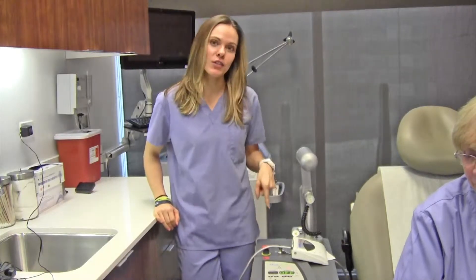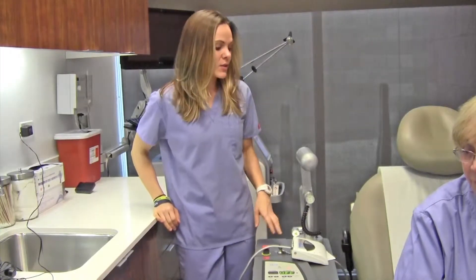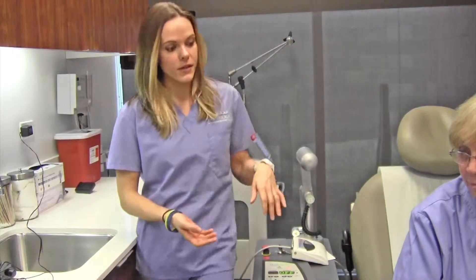Hi, my name is Jessica Neal, and today we're going to be talking about the tattoo removal laser. Not only can you remove tattoos with this laser, but you can also remove pigmented lesions, sunspots, lentigos, things like that, which is what we're going to be doing today.